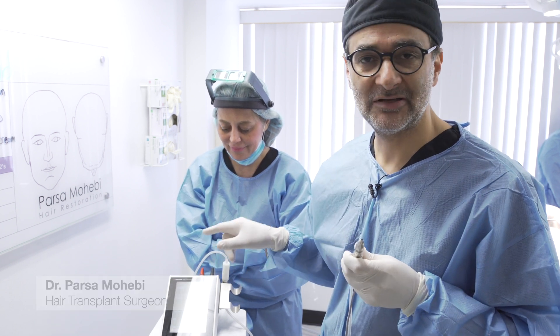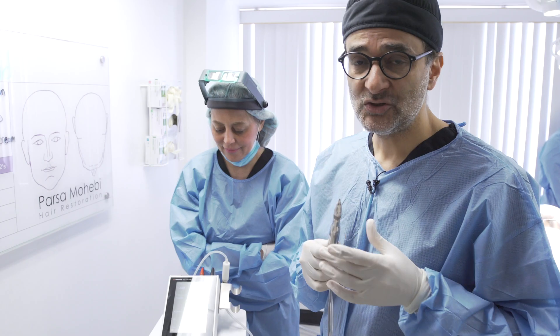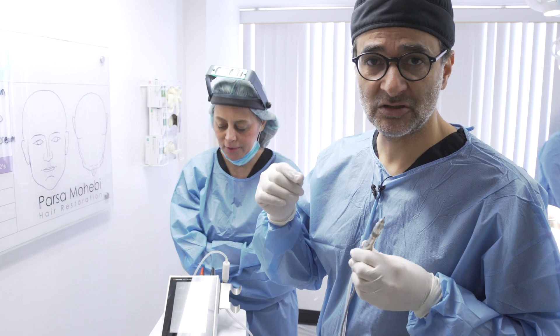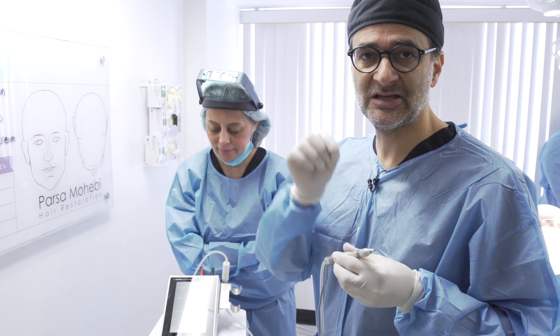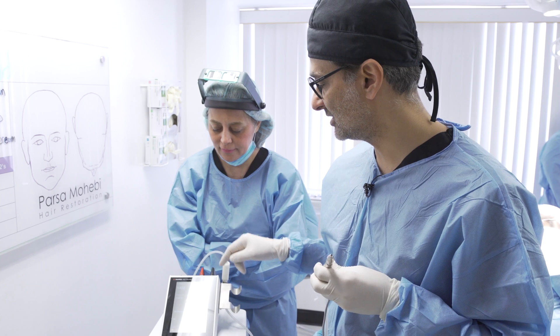Now that we learned how to set up the Trevelini system, I'm going to talk to you about the Smart React. A Smart React is a good addition to the Trevelini system, and a lot of users love it. Some people prefer to use the traditional method of using a pedal, but for people who don't want to depend on the pedal and just want to touch the skin and have the system start automatically, you want to know how to use the Smart React.